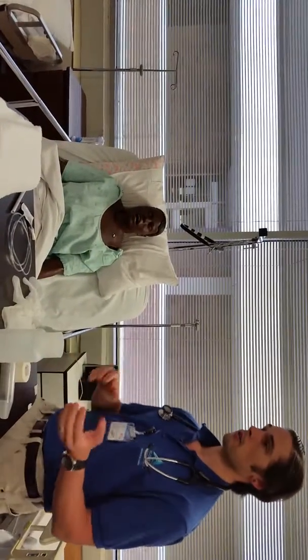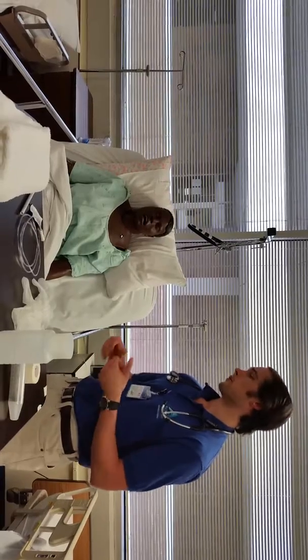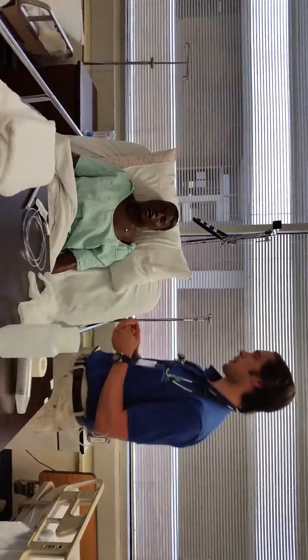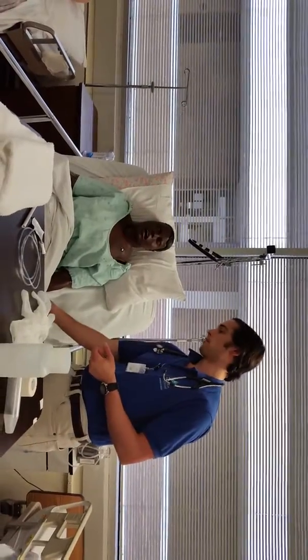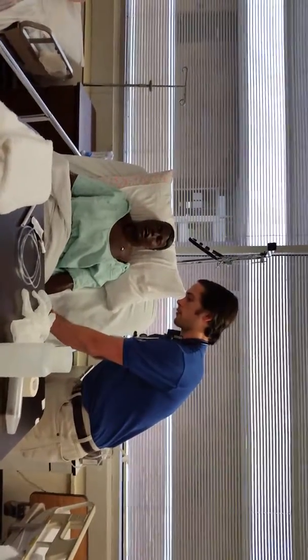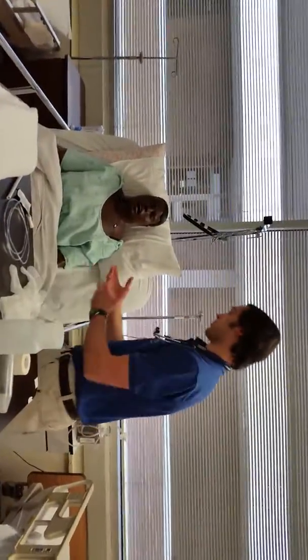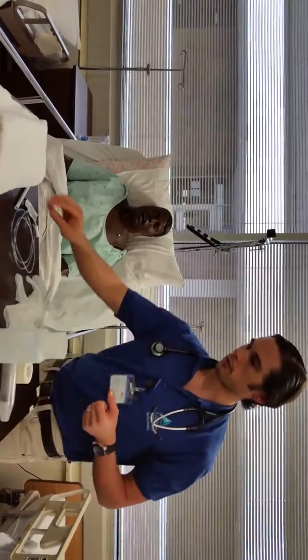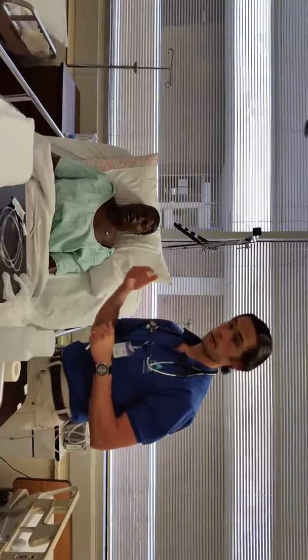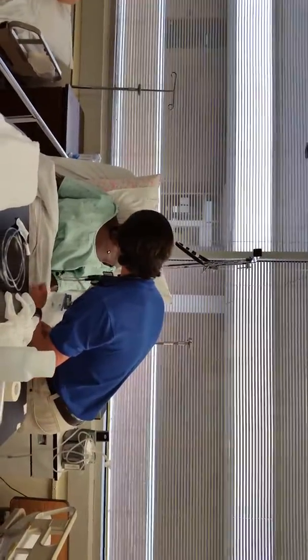I've got gloves. I'll walk into the room, introduce myself. Hi, my name's TJ. I'm a nurse today. I'm going to be putting an NG tube in. I just want to verify your name and date of birth. Wristband. All right, we have the right patient. Since she's already in high Fowler's, I'm just going to leave it alone, but I would put them in high Fowler's.